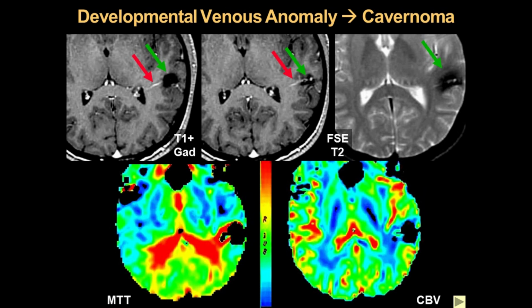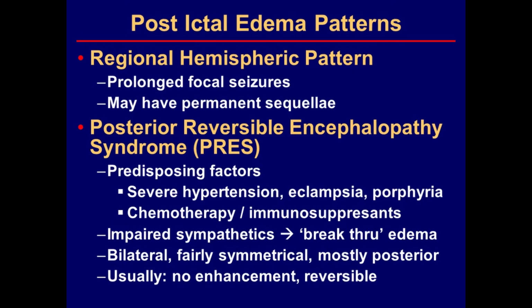We've seen that happen, a pre-existing developmental venous anomaly, later on hemorrhage in the drainage field. And if you use 3T systems with susceptibility weighted sequences, you'll see small cavernomas in a large number of the DVAs. How we deal with this, we're not sure. Unless they're symptomatic, they're really a don't touch lesion.